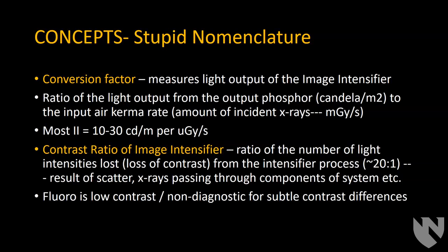X-rays to light. Contrast ratio would be the number of light intensities lost through the intensifier process because of scatter and X-rays passing through the system. So fluoro basically has a lower contrast ratio than regular radiography.